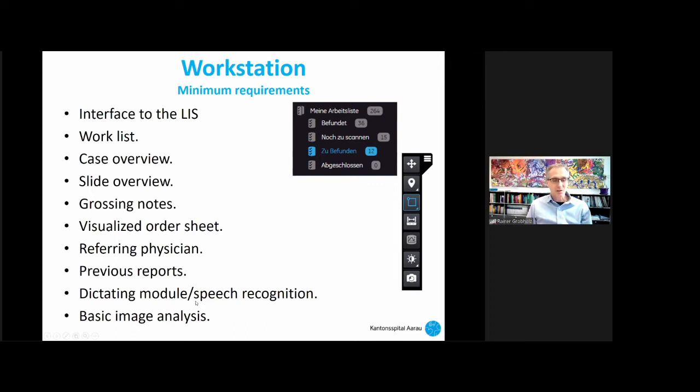What I learned is that there is no provider out there who integrates it into their digital pathology software. So in this case, you really need to have two windows with two different programs in order to deliver all your diagnoses and finalize your report.